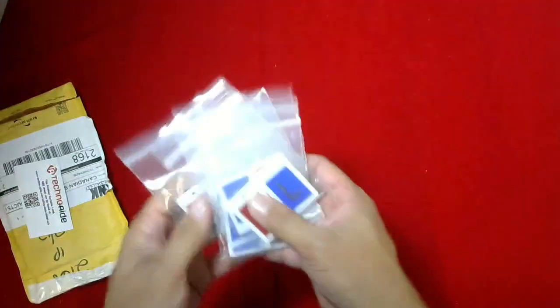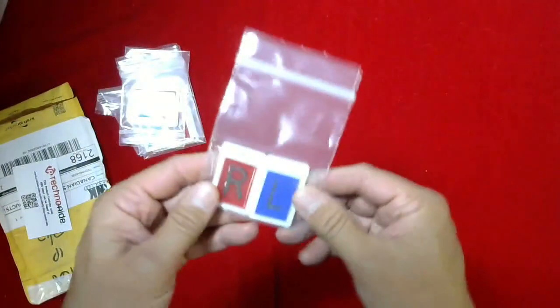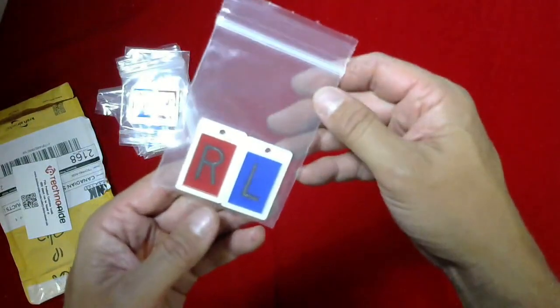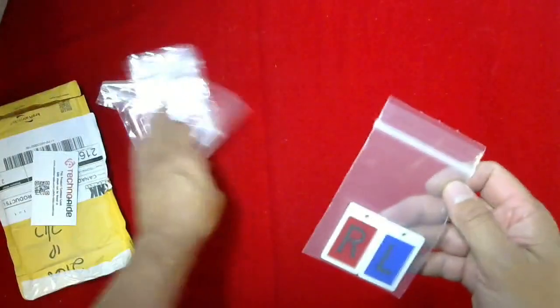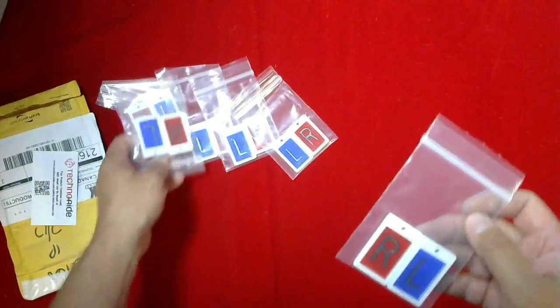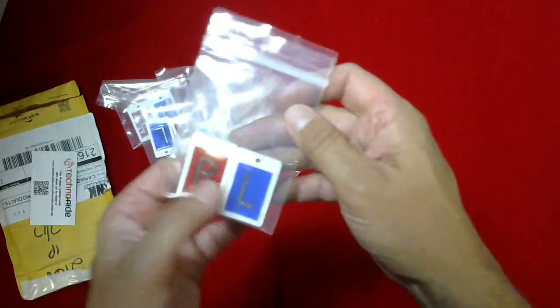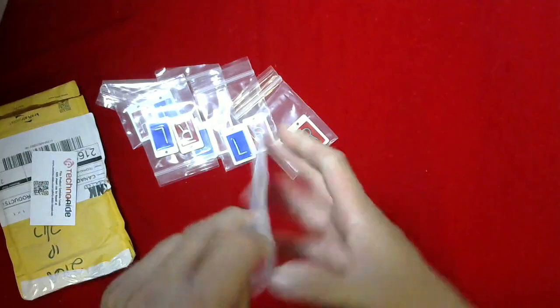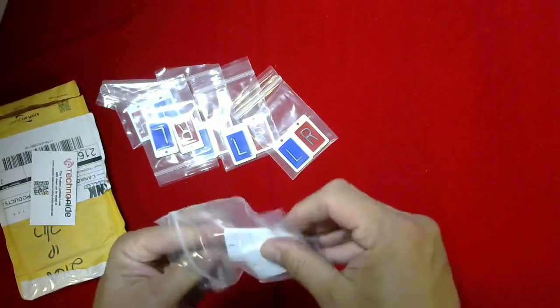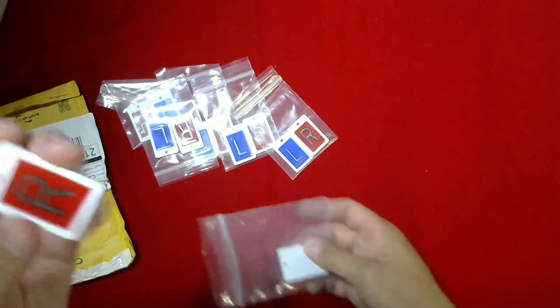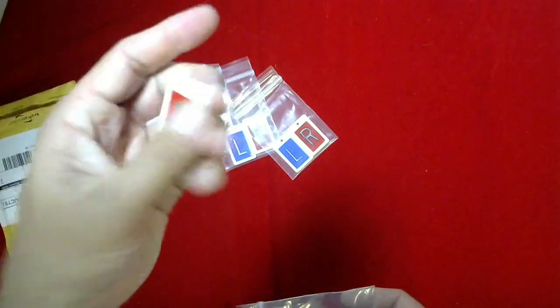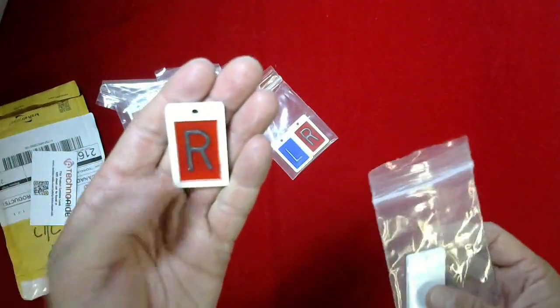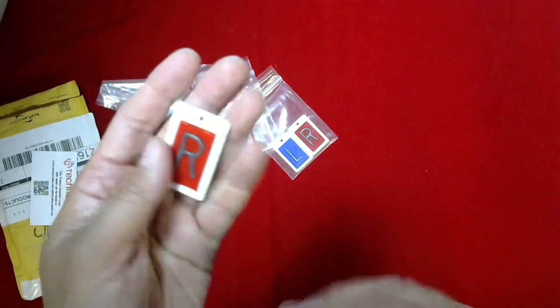These are x-ray lead markers. This customer bought, looks like, six of the same left-right markers. Fairly straightforward product, very popular mostly with teaching institutions and hospitals.